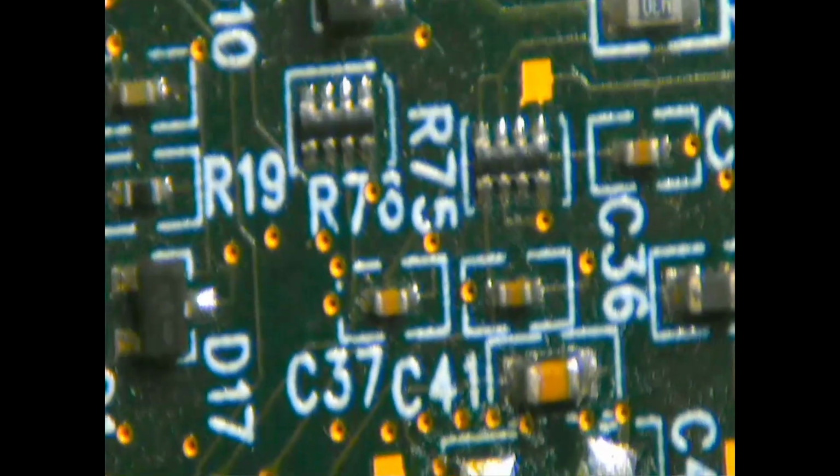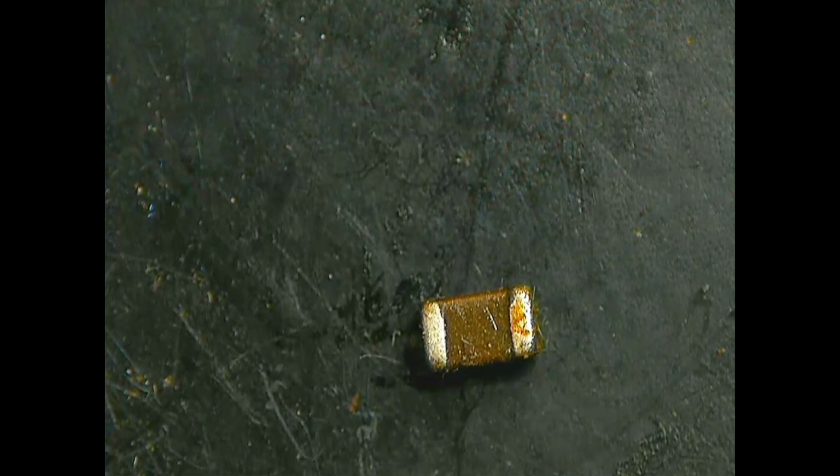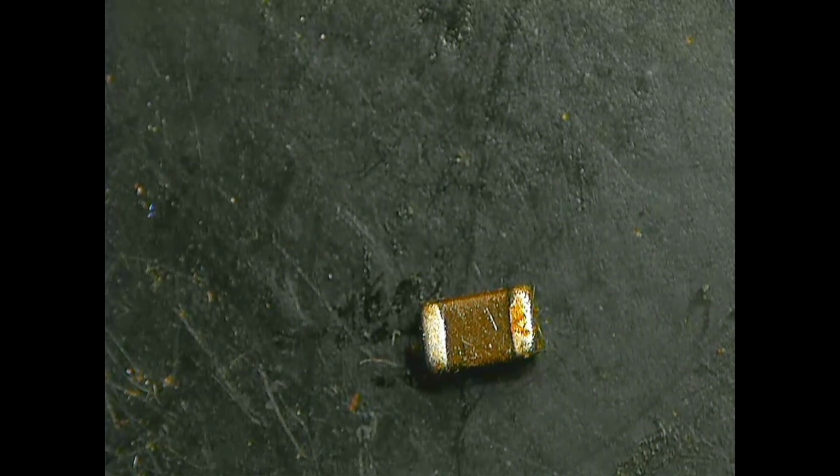Yeah, so we did it already, and we should find the same capacitor and replace it in this board. After that, this board will work. Yes, that's it for now. I'm going to clean my board now.